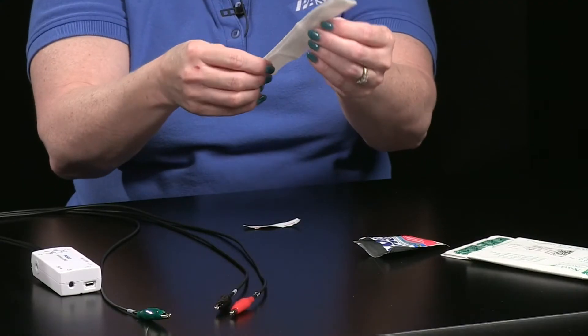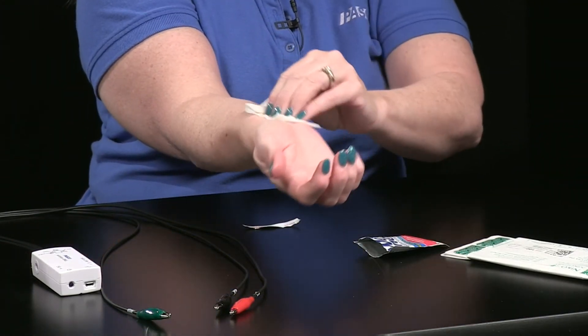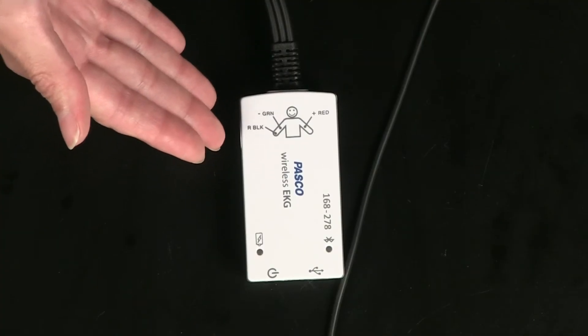The sensor comes with a pack of 100 disposable self-adhesive electrode patches. Before placing the patches in position, the subject should wash the areas with soap and water or use a cleansing wipe that contains no alcohol to keep the skin from drying out. Have the subject grasp the patches by the non-adhesive tabs and place them in the forearm positions illustrated on the sensor diagram with tabs facing towards the abdomen.